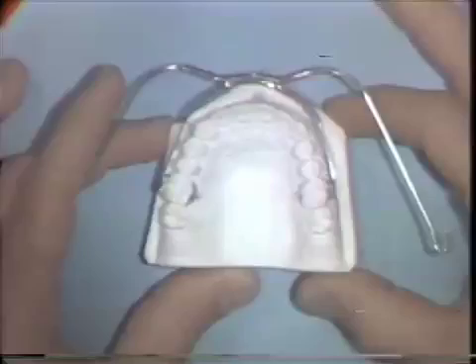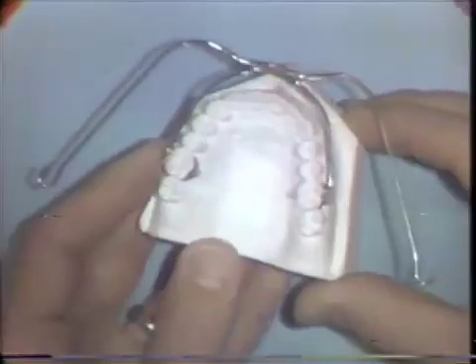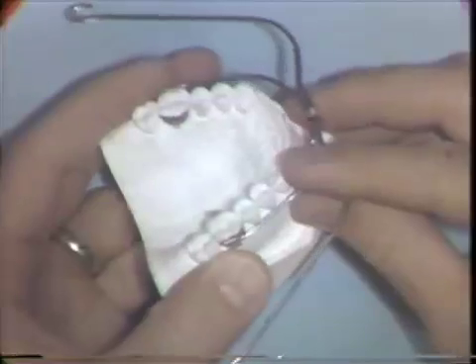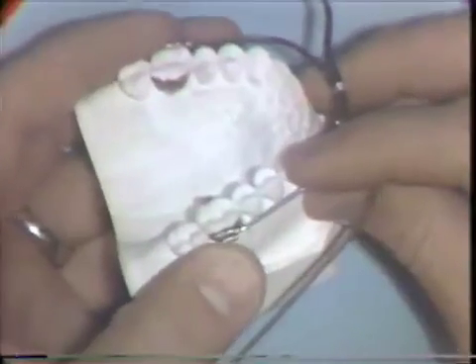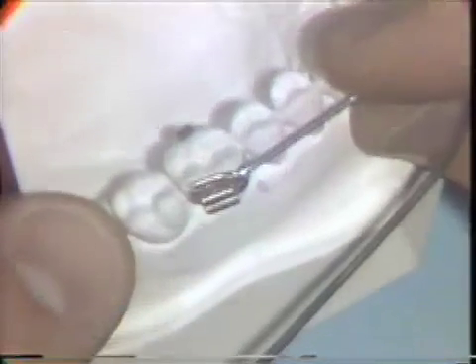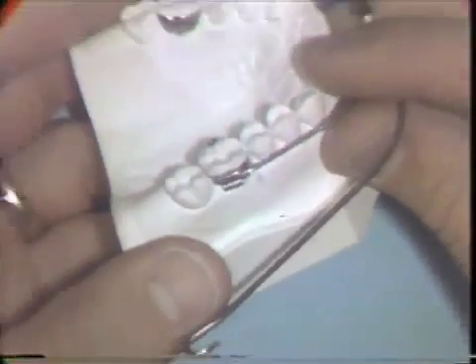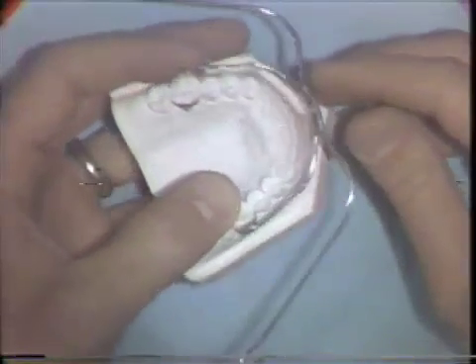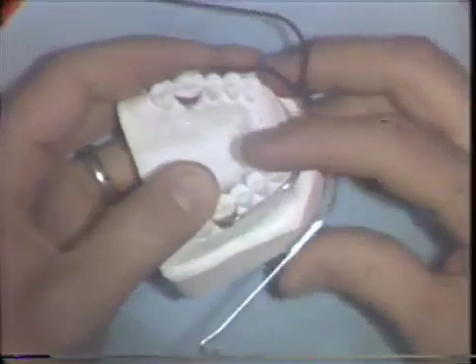The opposite side bayonet bend has been made, and the wire has been cut off that extends distal to the distal end of the buccal tube. The end of the Facebow inner bow is rounded with separating discs and rubber wheels. The next step is to adjust the wire for passiveness.